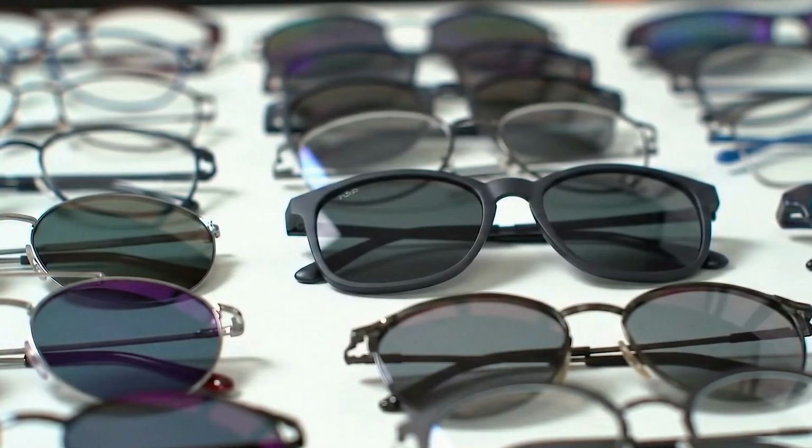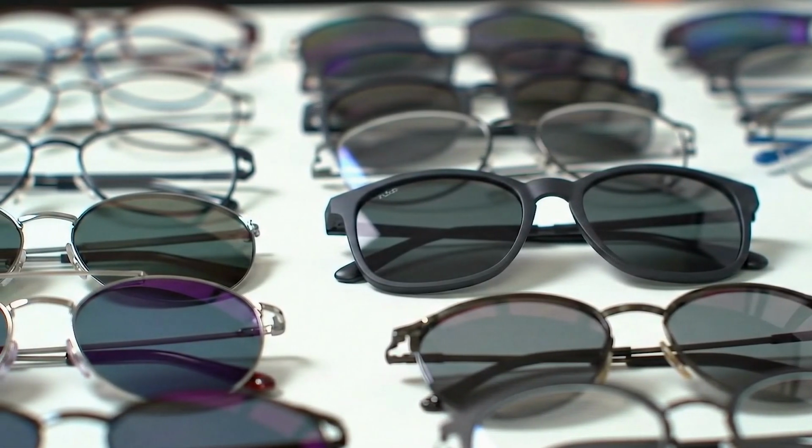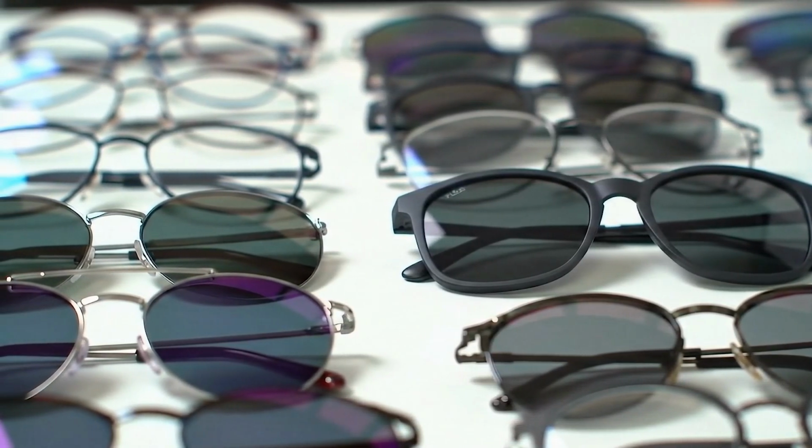When you're prescribing a high ad, your lens options shrink down a little bit. If you're used to getting a polarized lens with a flat top, or Transitions with a flat top, or progressives with various features, when you do a high ad, you are going to be limited. A lot of the high ads are only available in CR39. So before you go on a binge selling all the bells and whistles in a pair of high ad glasses, definitely call and make sure that it can be made. Most of the time we can make something work, but it's best to check before you put your foot in your mouth.